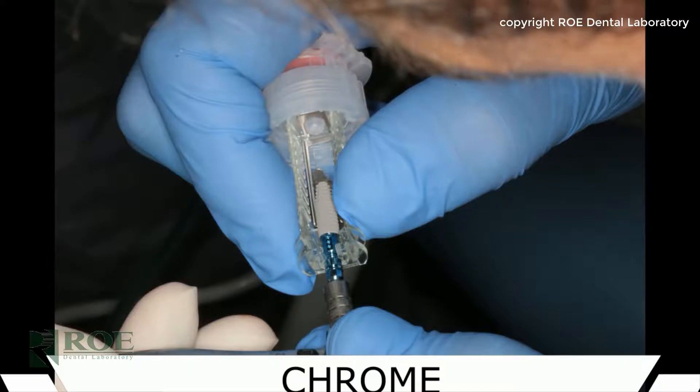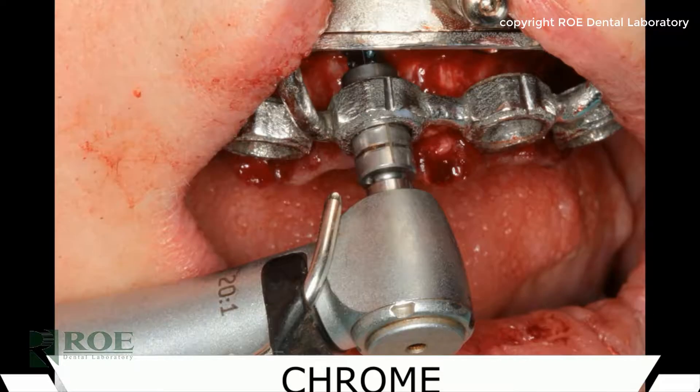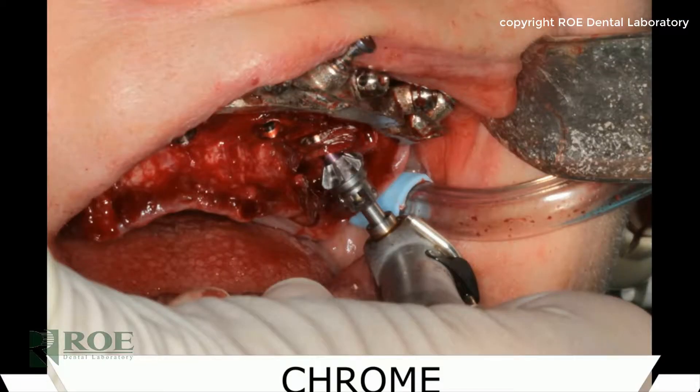The BLX system has an aggressive implant thread and comes with custom inserts for the osteotomy guide. You'll notice in some of the images that there are plastic inserts that fit into the osteotomy guide to accommodate their drill. Once all the implants are seated and placed, then the next step begins.